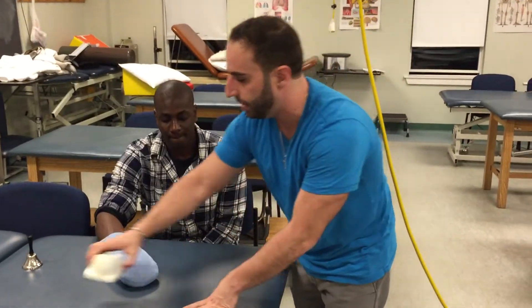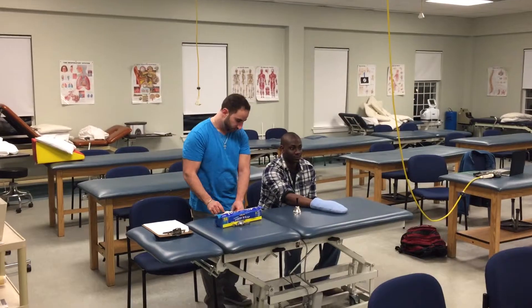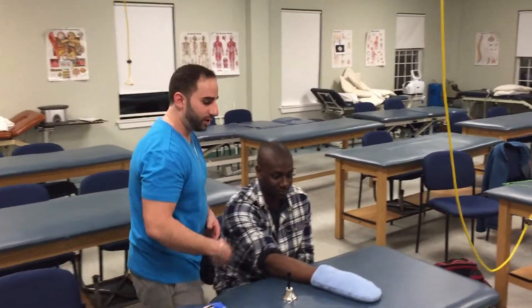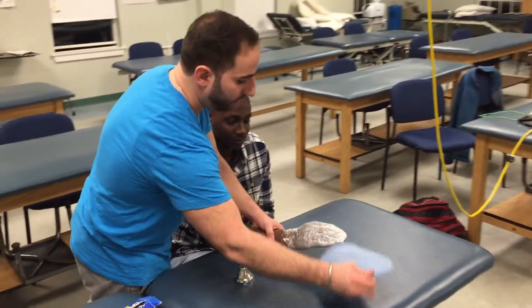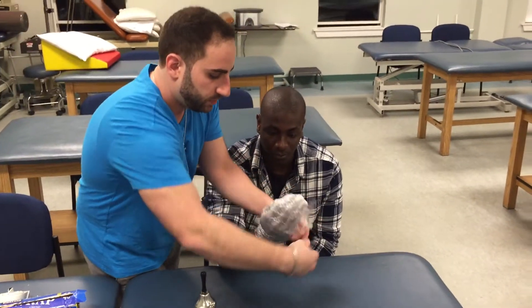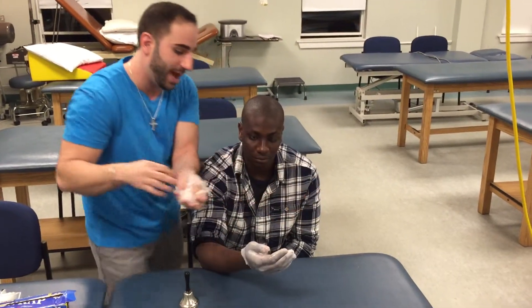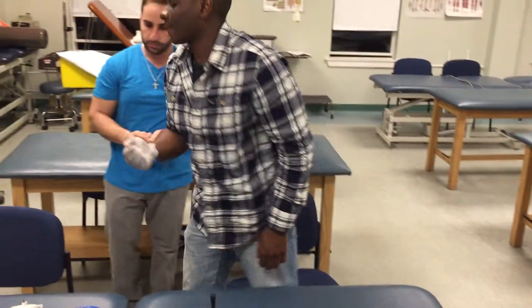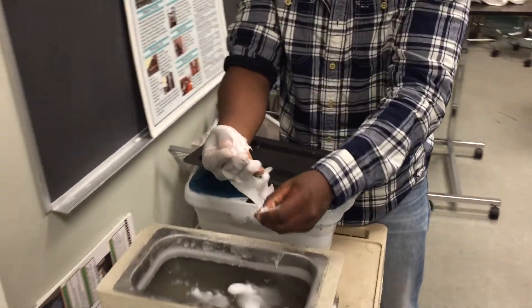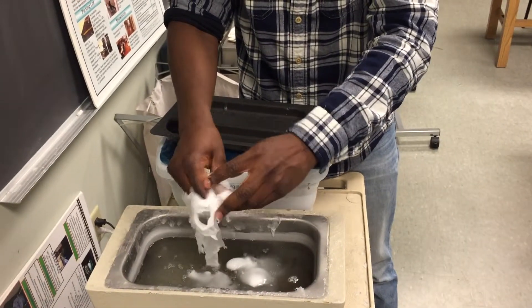Always instruct the patient that if they have any questions or concerns to ring the bell. Once you hear the bell ring after about 15 minutes, come over to the patient, remove the glove, and then take off the saran wrap.